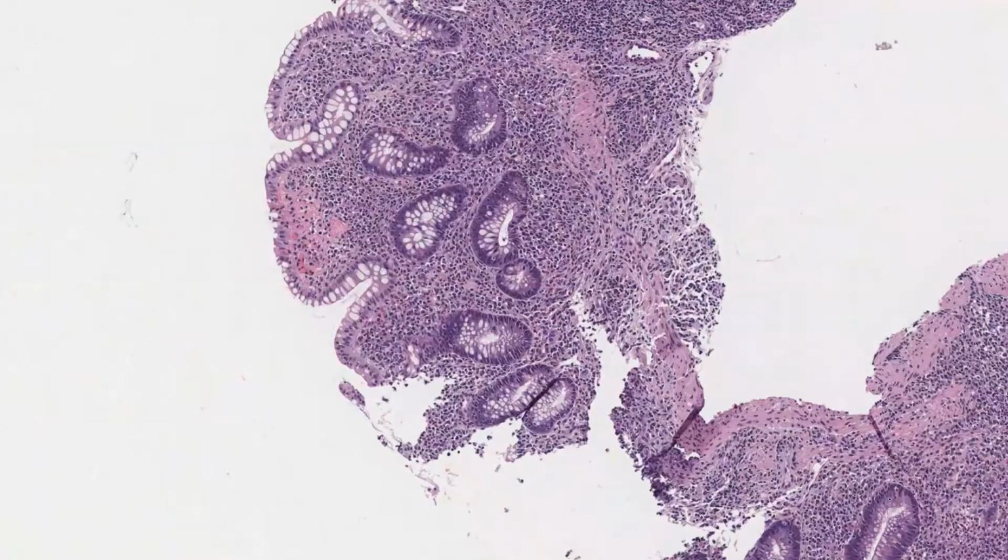Sometimes when it is a little bit subtle, it can be difficult, but again, this is not normal. These are broad, short villi. This is not particularly normal. It's subtle, it is early, but this is not normal. I would pay a lot of attention, or I will be basically very aware. I will wake up as soon as I see the surface has got something like that.